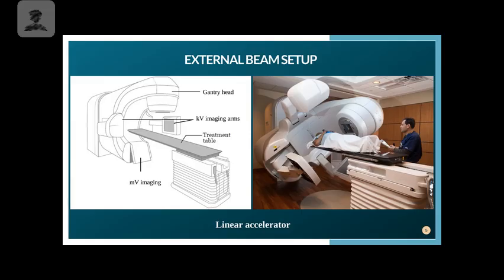What you're seeing here, with a diagram next to it, is what we call our treatment couch. The black part is the table that extends out and allows the patient to be underneath what we call the gantry. The gantry is this whole structure that's above and below the patient. What's really nice is that the table goes up and then pushes forward, so it can be in its separate location away from the stand. And it has a lot of flexibility.